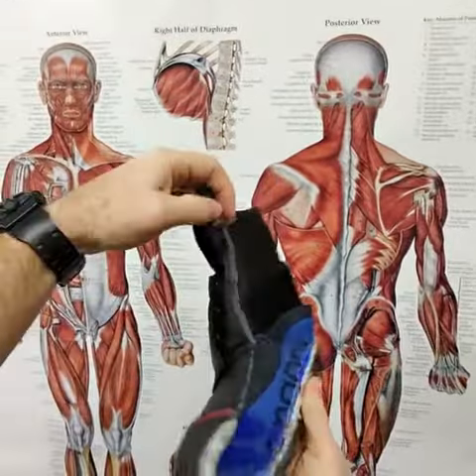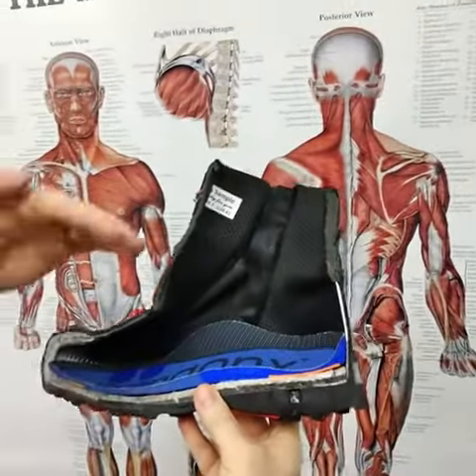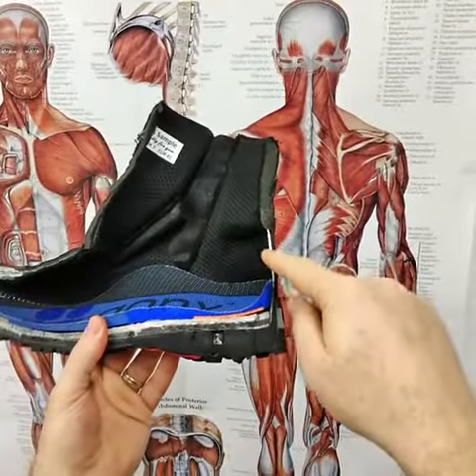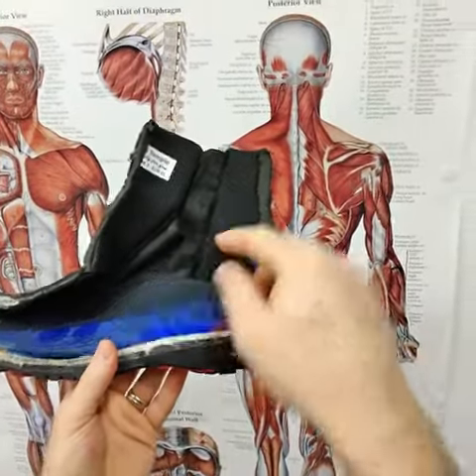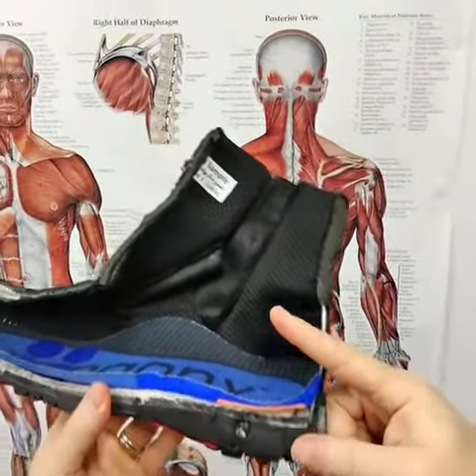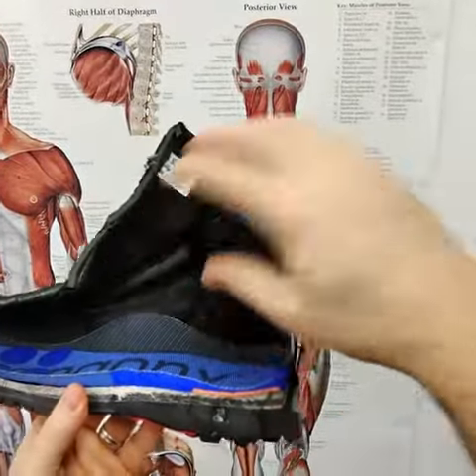I've got the laces out here obviously. The reason for that is we can tighten the laces down on the foot and then it pushes into this section of the boot, which is the heel counter. The laces push down this way and the heel counter will push back up this way, and that helps to lock the foot in place in the boot.